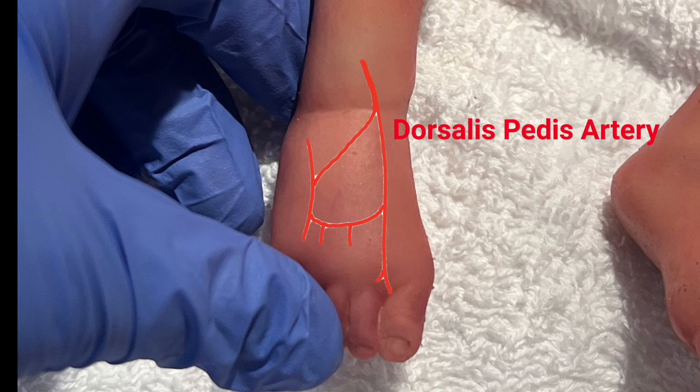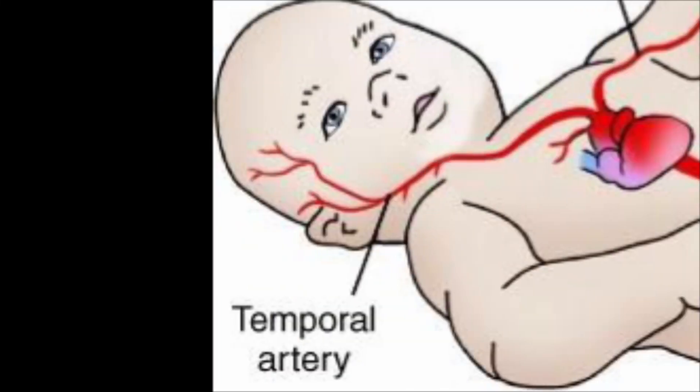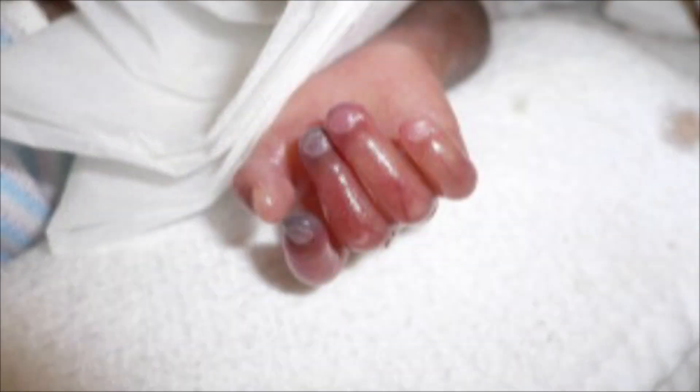You can also use the dorsalis pedis artery, but it is often small or absent and may be inaccessible in some infants. You should use the brachial artery only if the indication is urgent. Temporal artery should be avoided, and ulnar should be avoided because of the risk of impaired circulation to the hand.